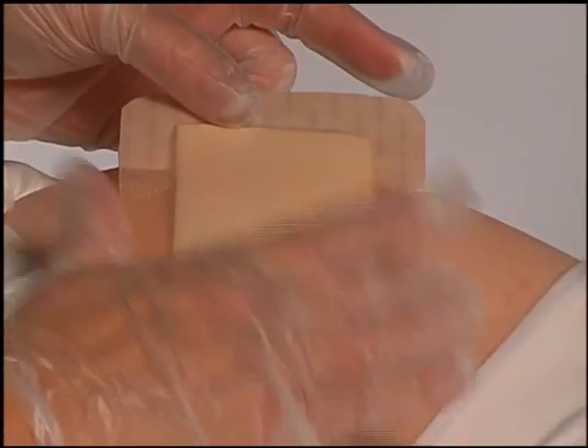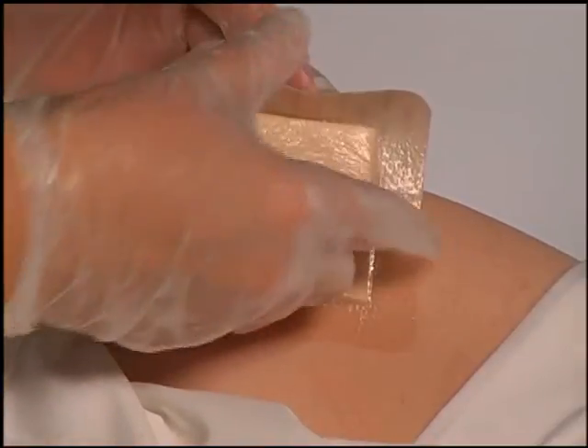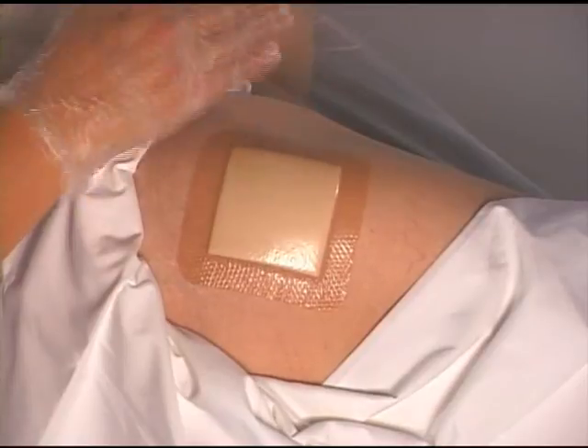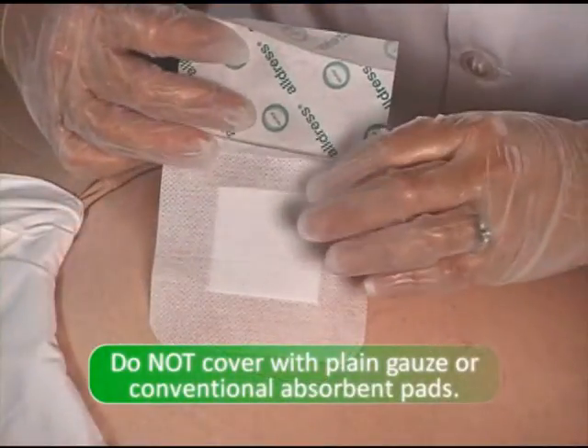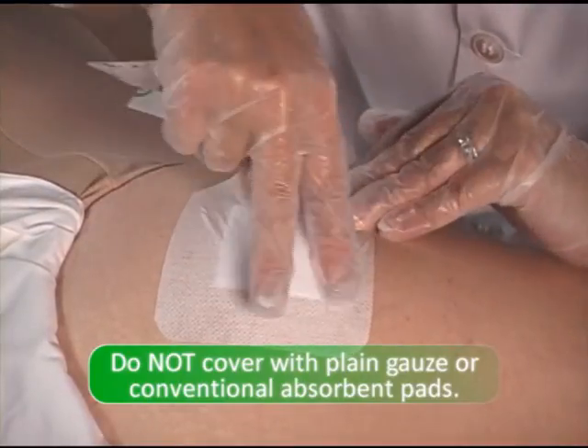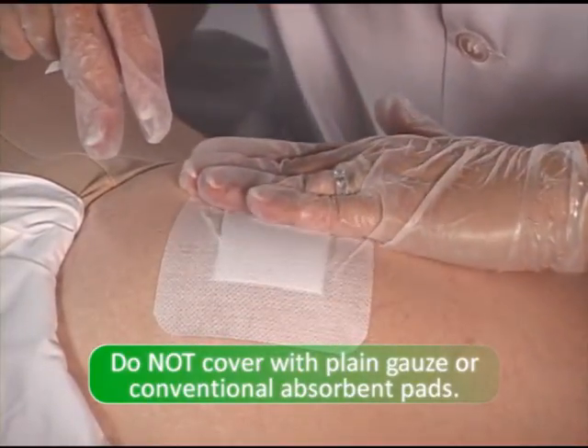Cover Hypergel with Mepilex Border, Allevyn, or other secondary dressing suitable for use over hydrogels. It should not be covered with plain gauze or conventional absorbent pads, as these will serve to wick the Hypergel up and away from the wound surface where it is needed.